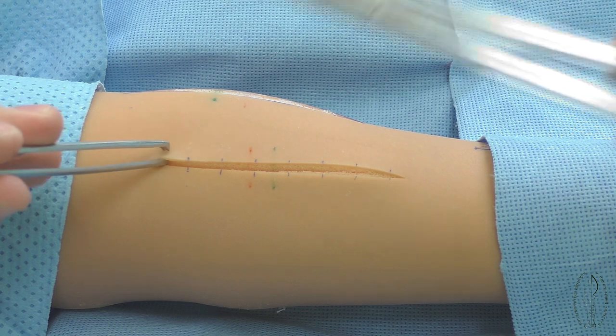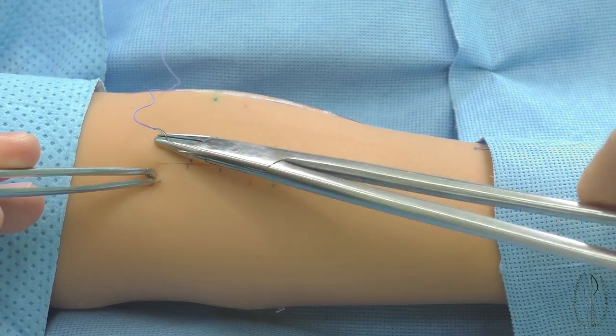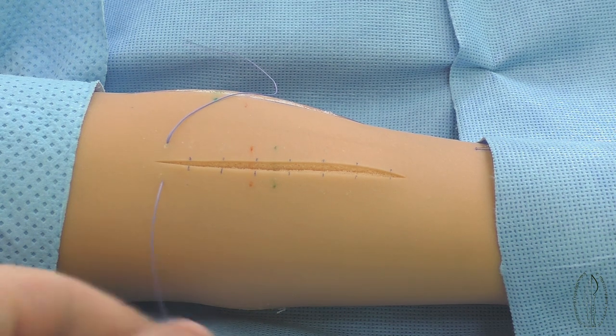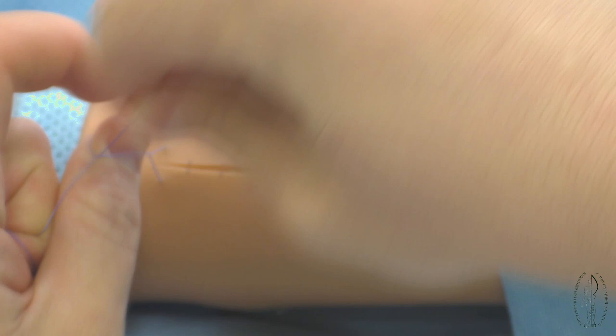The first stitch of making this suture is similar to a simple interrupted suture technique. After the needle output through the closest edge of the wound, a primary fixing knot is made according to the rules.